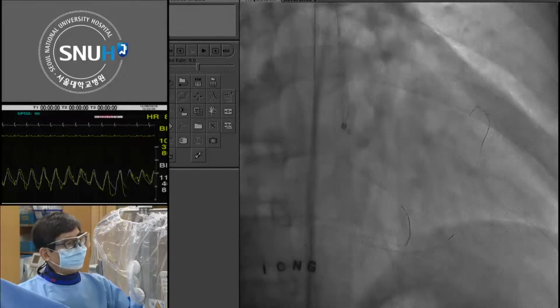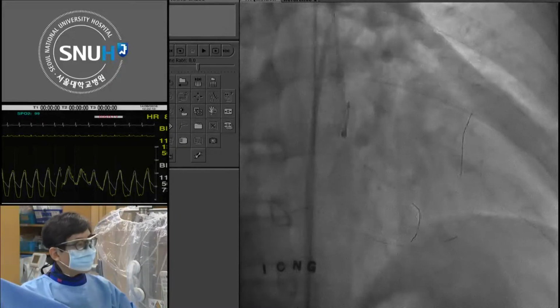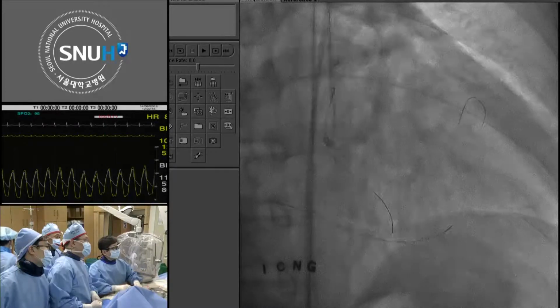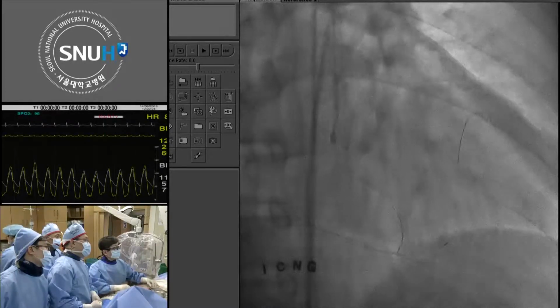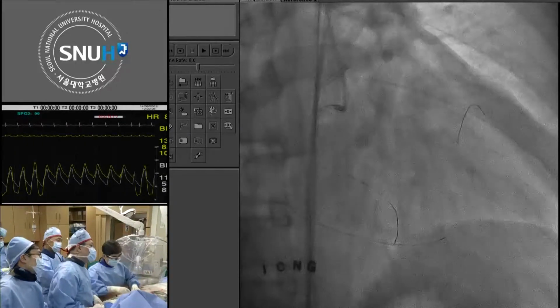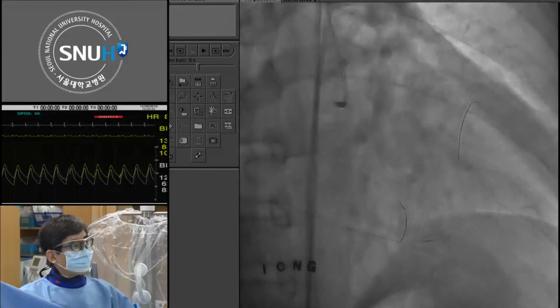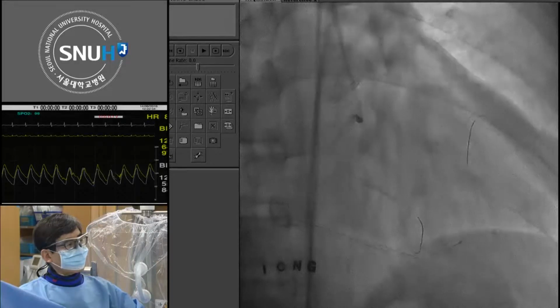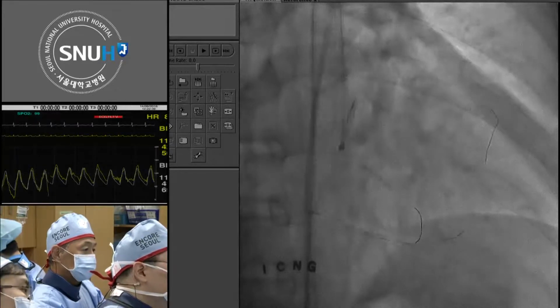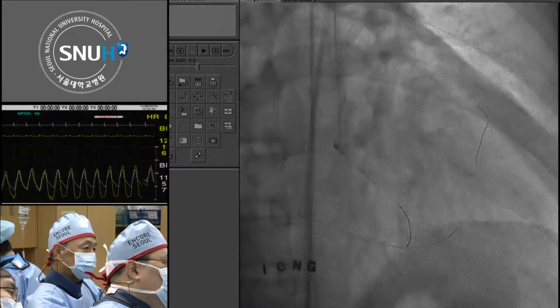Make sure the guiding catheter, because it's still resistance. Maybe this channel is very tiny. Yeah. So why don't we try ballooning? Ballooning is one option, by 1.0, because 1.5, 1.0? Okay, 1.0 balloon. But you try again. It looks better compared with the previous Corsair. Still, the guiding catheter is prolapsed.